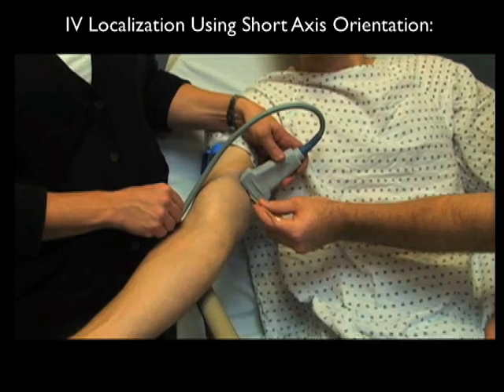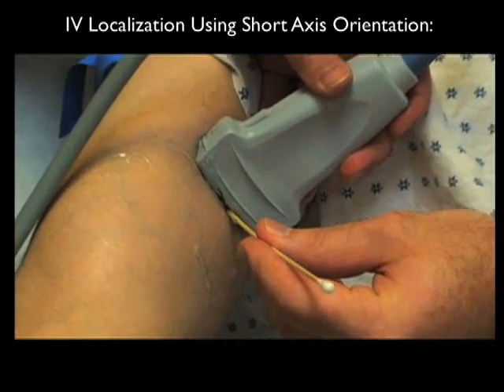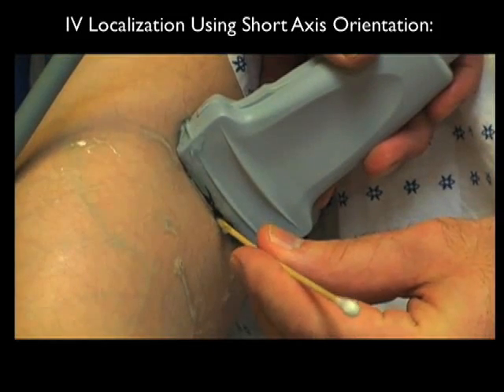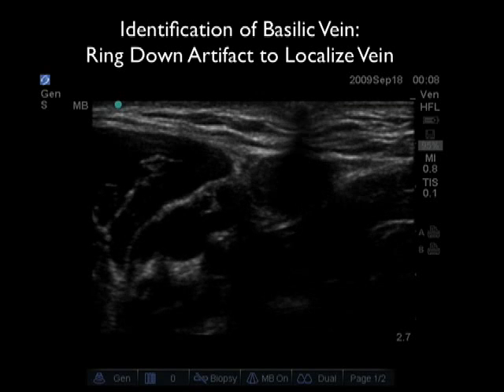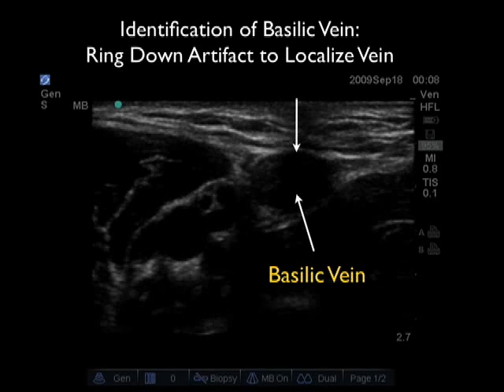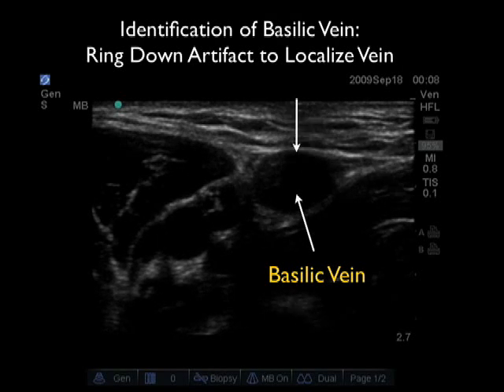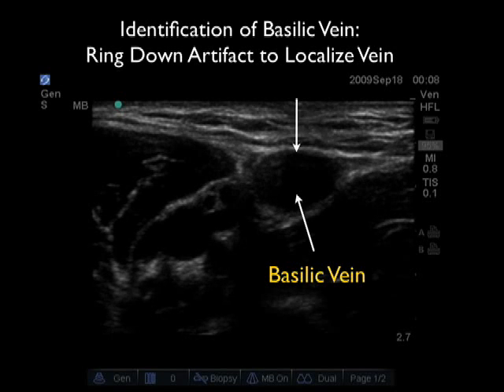Here's how to localize a vein using first the short axis orientation. Notice the probe is placed in a side-to-side configuration over the patient's basilic vein, and we're coming in with a Q-tip angled at 45 degrees right underneath the probe, pushing down to look for something called the ring-down artifact. This allows us to localize the vein in a side-to-side orientation. Here's the ring-down artifact on the ultrasound screen — notice it's a dark mark that emanates from the surface down towards the basilic vein, allowing us to mark the location for the poke point.